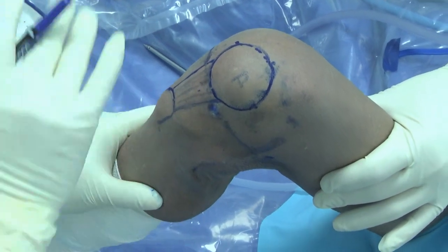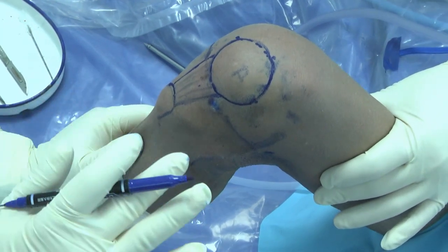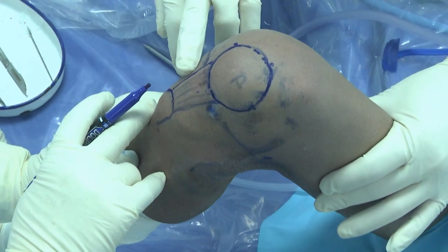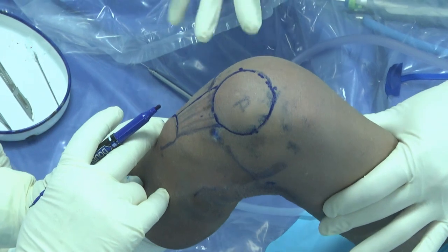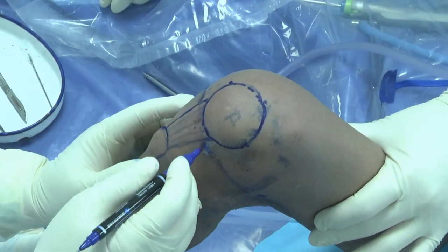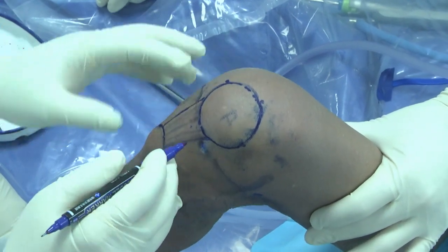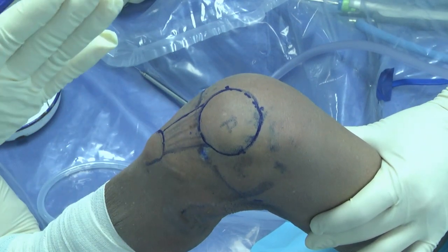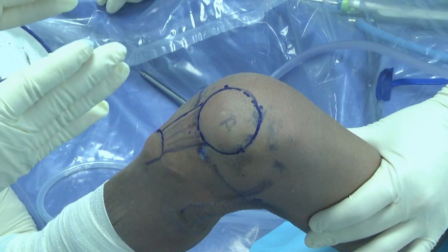So that's all the portals I want to mention, and then we can go for portal placement, and then we do harvesting. Is there some difference between normal knee arthroscopy and ACL reconstruction? Do you change the portals? These two portals, I rarely change. I always use these two portals because most of our work is in the notch. In ACL, PCL, we need to put the portal close to the center.